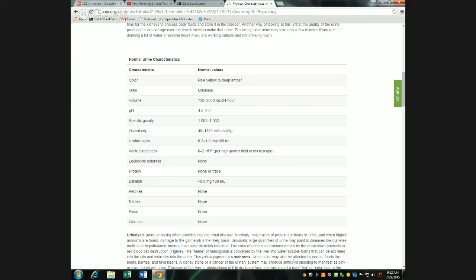So for instance, the first one is glucose, and you would expect in a normal sample for it to be this kind of pale teal color. Mine, of course, is green tea that's been sweetened with Splenda, and I added the chai to it. So it's going to register as very full of glucose because it's been sweetened. And I've done this without the chai, and it still reacts like this. Splenda, since it's chemically so close to glucose, reacts similarly. So you can just compare each color reaction across the bottle.